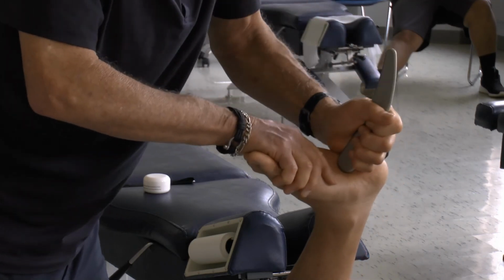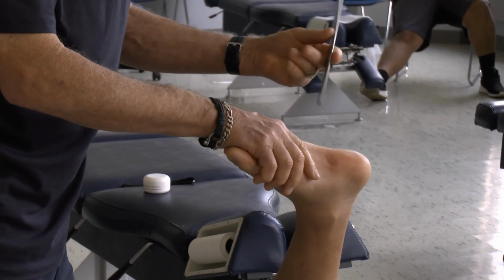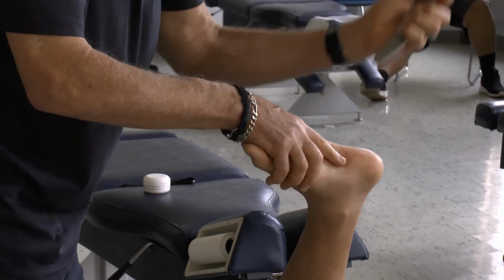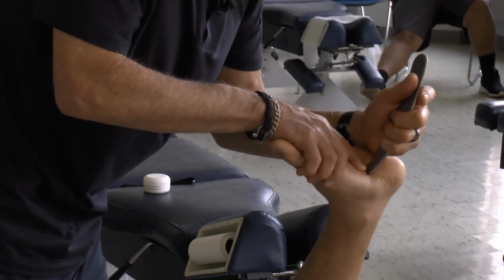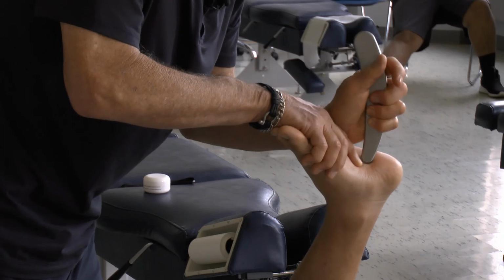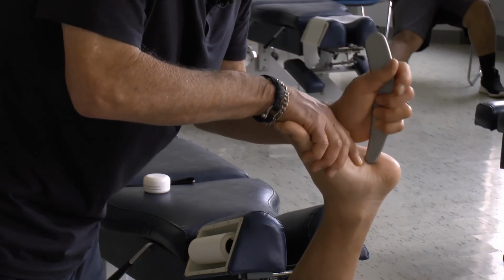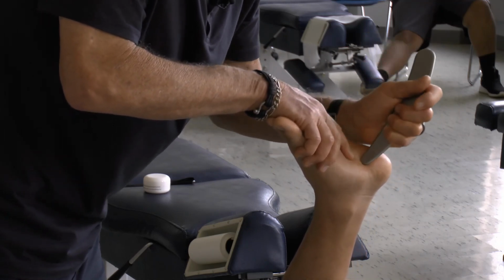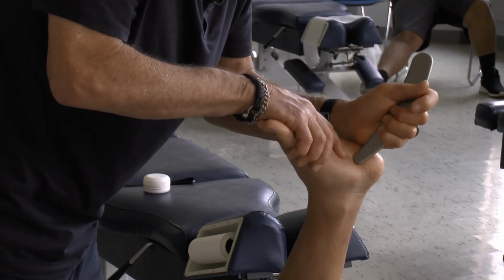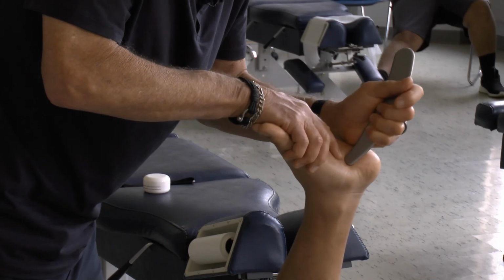Doing okay? And if the patient will tolerate it, I could even try it out with my smaller edge. So I just come in with my small convex edge. Perhaps not go as deep because it's more concentrated, but it gets me into a smaller area. You okay? Yeah. All right. I can tell that's just at the lateral limit of tolerance right there.